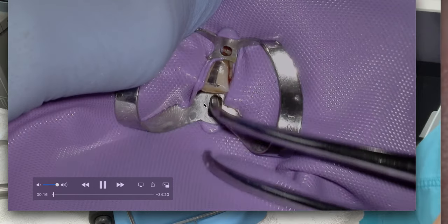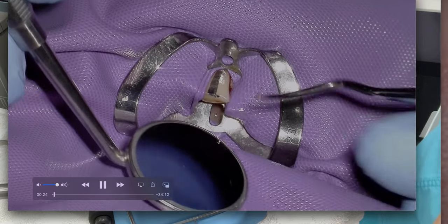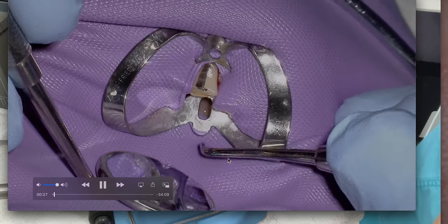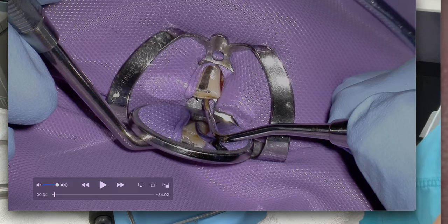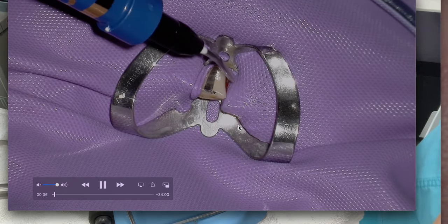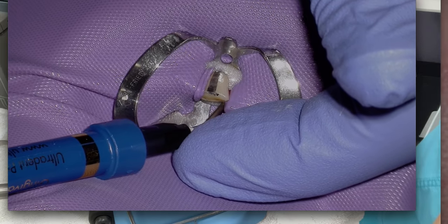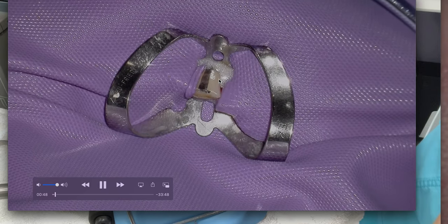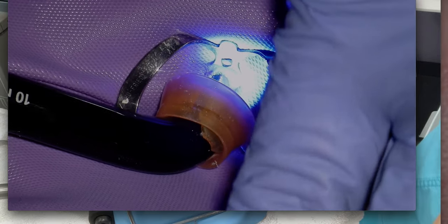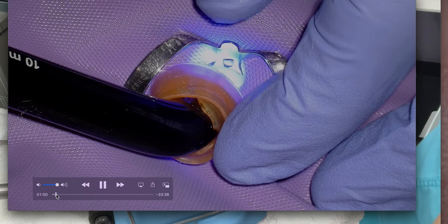With the labial bow you put it all on at once, then take your spoon excavator and flick the rubber dam off the wing — clink, clink — just like that. You can take some floss and floss that down. Then these little windows between the tooth — I'm going to fill those in with a secondary seal called Opal Dam, which keeps our caustic irrigants out of the mouth and bacteria out of the tooth. I've been using Opal Dam successfully for seven years, but I'm starting to use more OraSeal — it's a different product, light-curable, and it actually expands when wet.